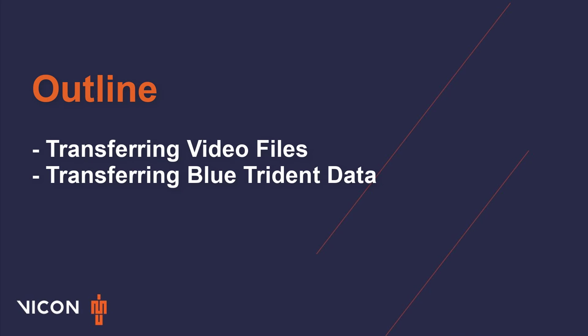Welcome to your Nexus 2 tutorial. This video covers the basic workflow for managing your reference video and IMU data post-capture. It is important that these steps are completed soon after capture and must be completed before any trials or folders are renamed or relocated.